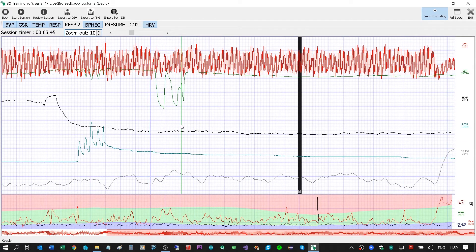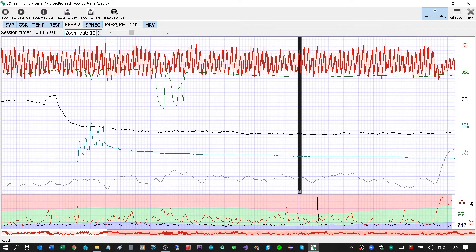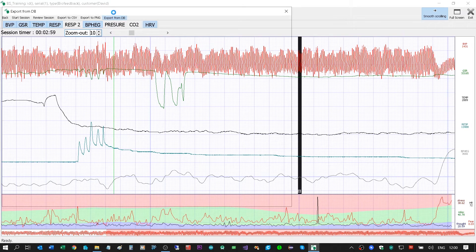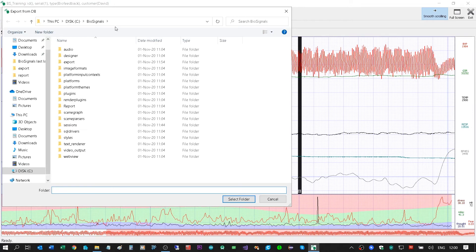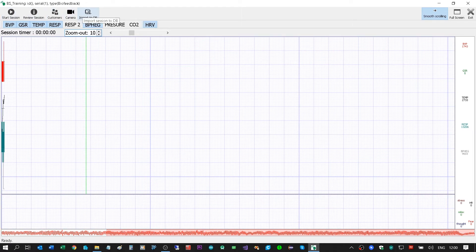I can do a training and watch the result in both ways: web page display with graphs, or application display with signals. I can choose different sensors by clicking the buttons. Additionally, I can export this data to CSV files, and also export this training from the database — it will ask me where I would like to export the files.